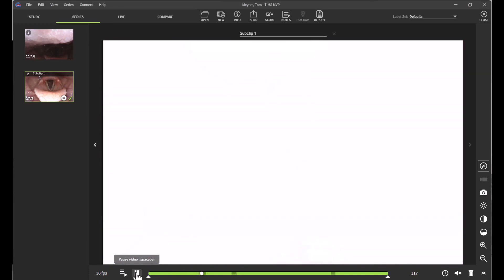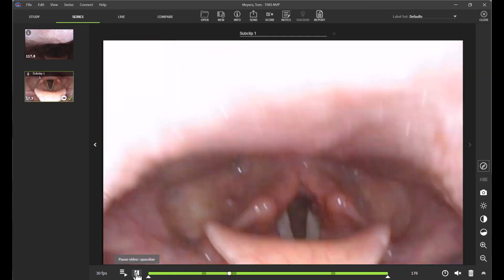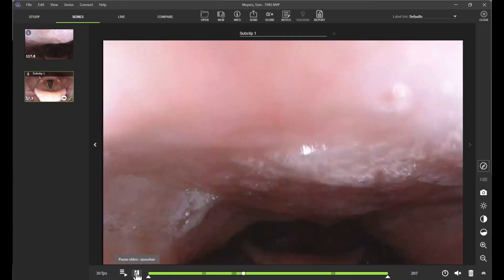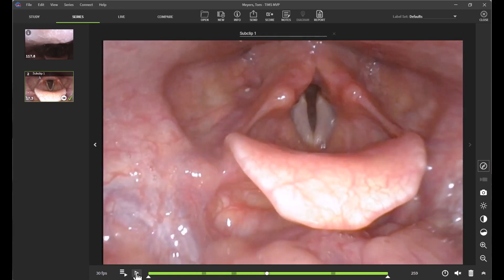You'll notice that as the circle approaches those grayed out areas, that is when a swallow occurs. We hope that this video was helpful. For more information, please reach out to us.